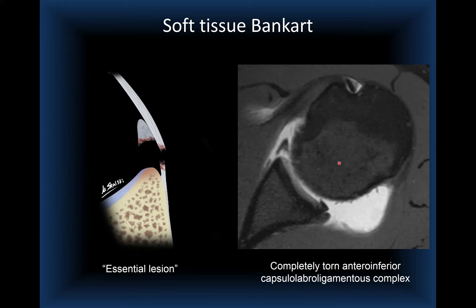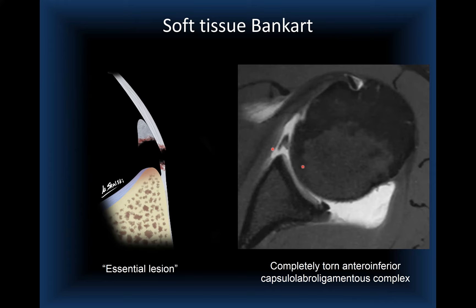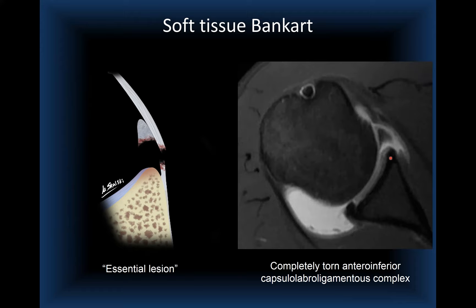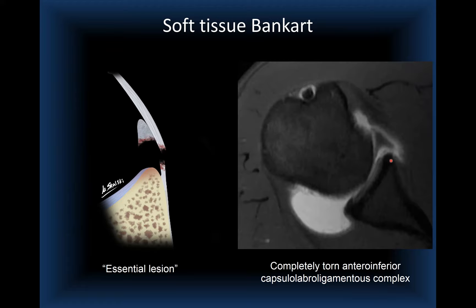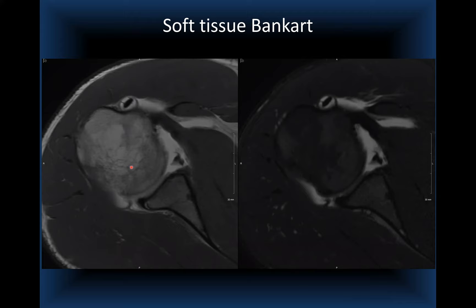On axial T1-weighted MR arthrogram images, you can see complete detachment of the anteroinferior labrum with disruption of the periosteum. As we continue inferiorly, the whole complex is detached. Another case shows the anteroinferior labrum completely separated from the anteroinferior glenoid rim, and a third case on T1 non-fat-sat and T2 fat-sat confirms complete detachment of the soft tissue Bankart.